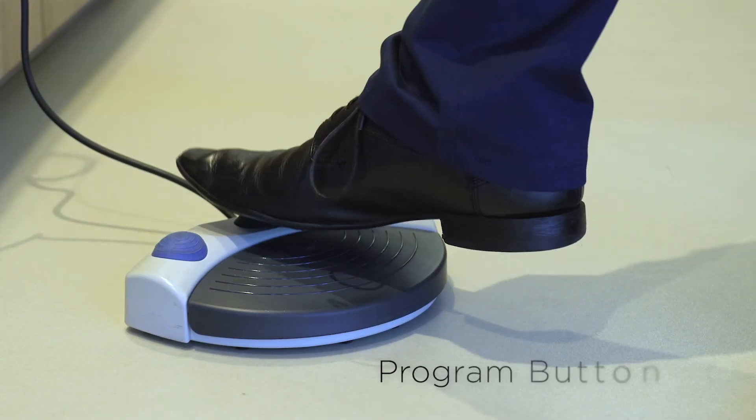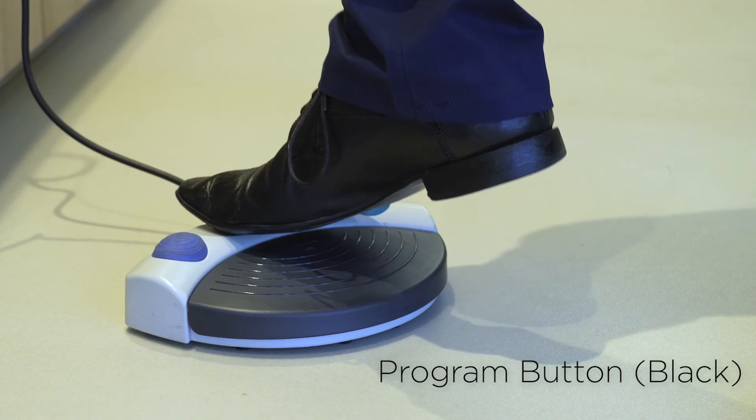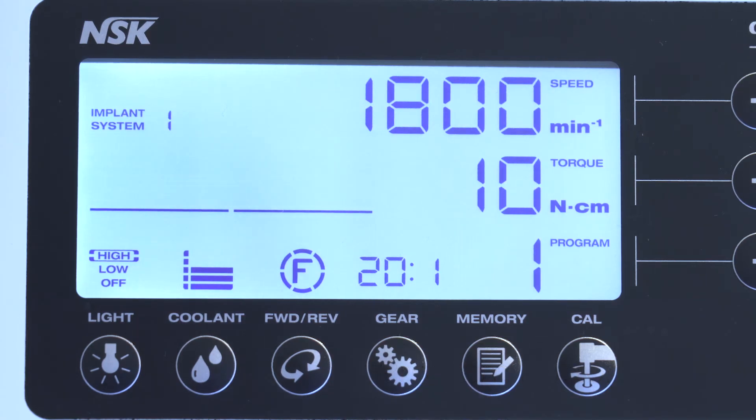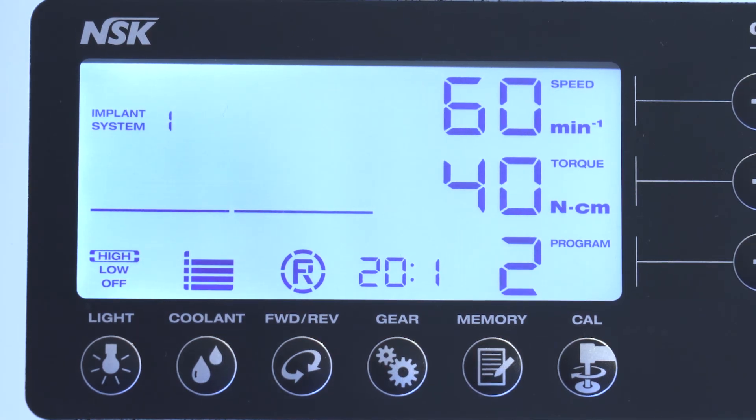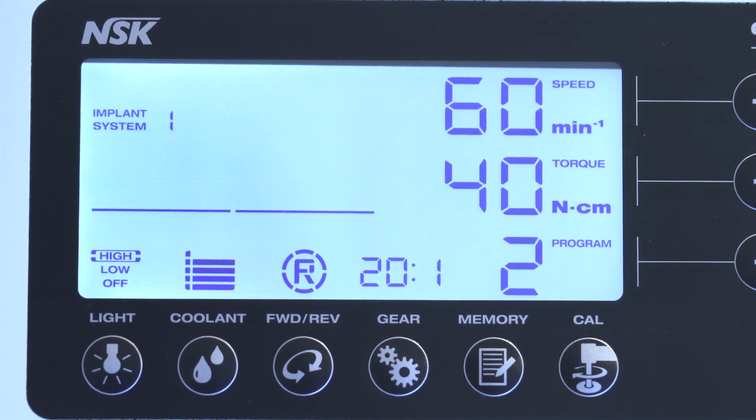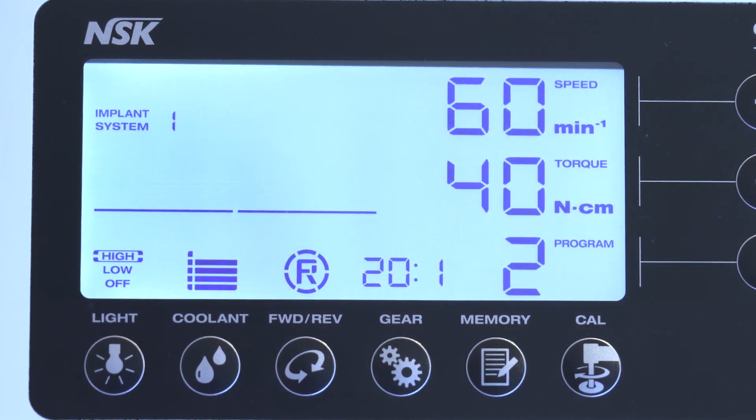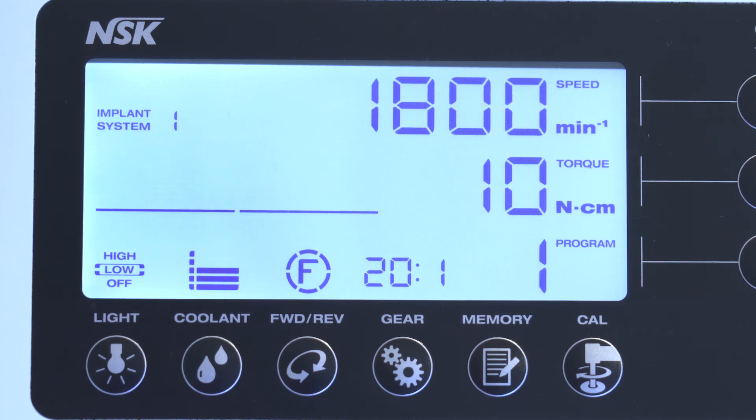Program Button Black. Use to select the desired program number. Program numbers will always ascend each time the button is pressed and released. To descend, press and hold for 1 second and release.